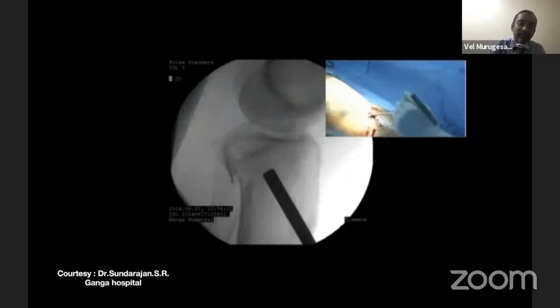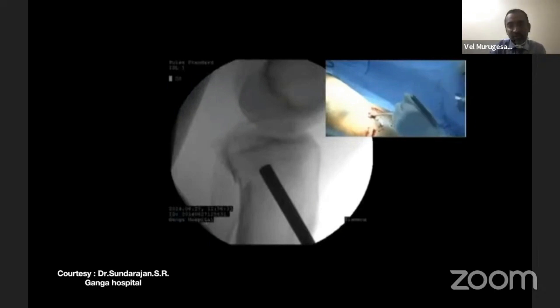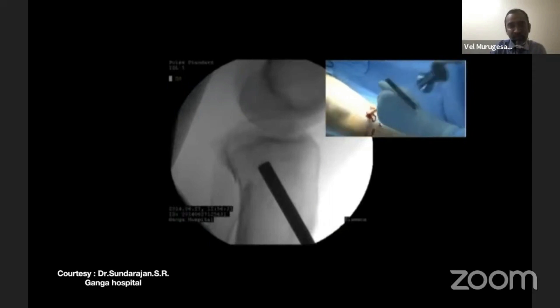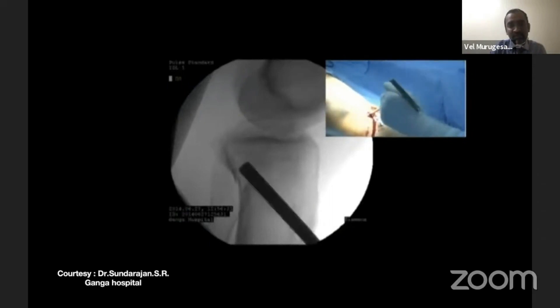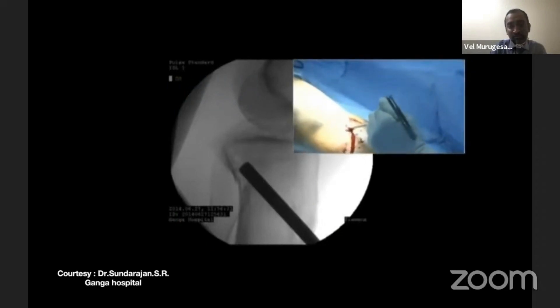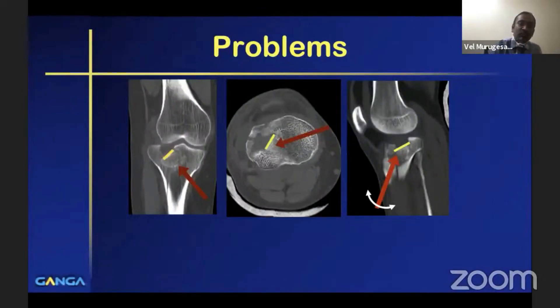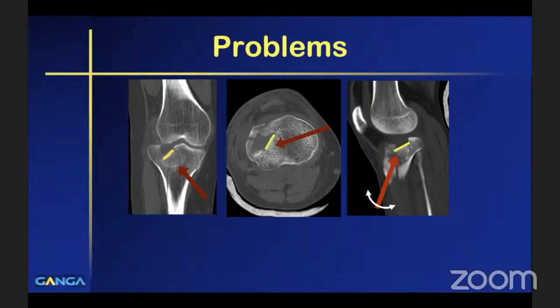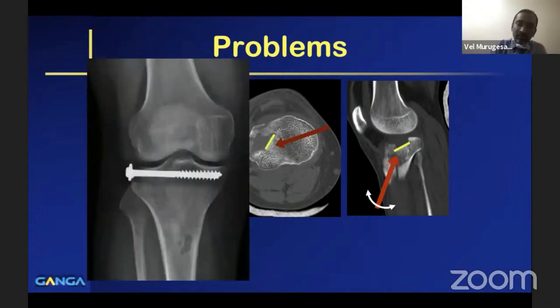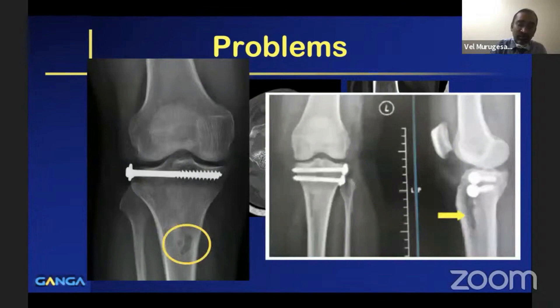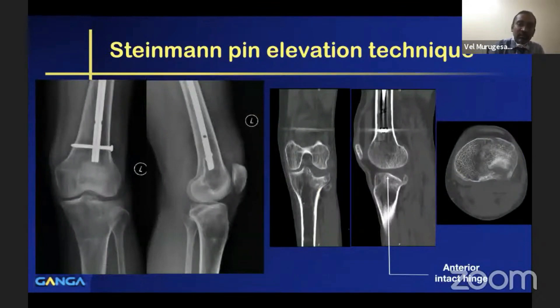Since the anterior hinge is intact, we find the fragment elevates evenly, and elevation can be performed under image control alone. The problem arises when we cannot get the elevation rod from the medial side perpendicular to the depressed articular surface. In those cases, excessive maneuvering can result in widening of the medial window, which can act as a stress raiser.